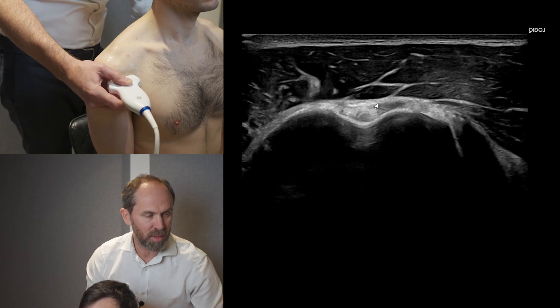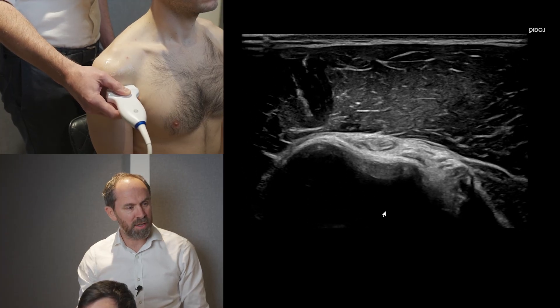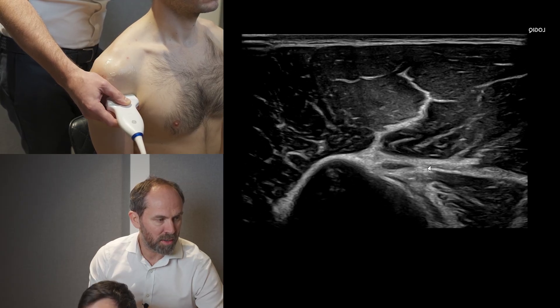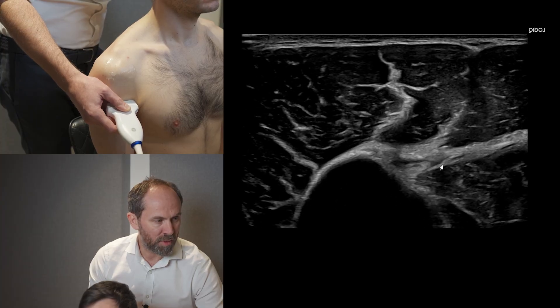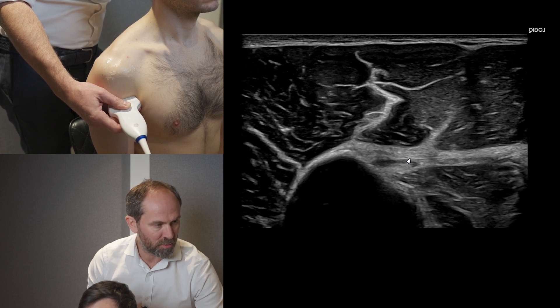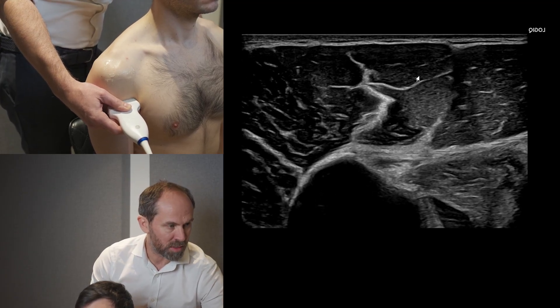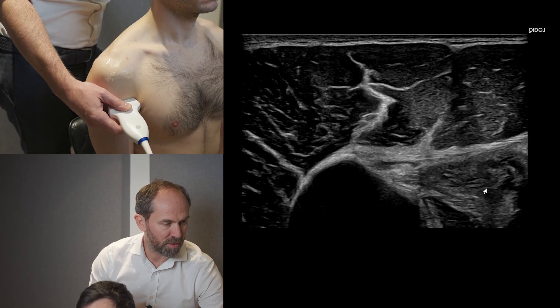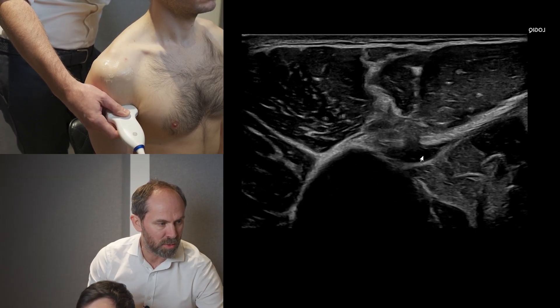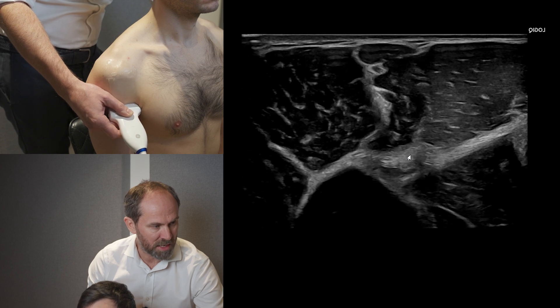As we follow further down, continuing to tilt slowly and keep the bone bright, we look for a structure coming from the medial side — that's the pectoralis major insertion attaching onto the humerus, a nice fibrillar structure running left to right. On top we have the deltoid with its multiple intramuscular tendons. Medially underneath pectoralis is the short head of biceps, and as we go more distal, the long head of biceps muscle belly comes up from the tendon.